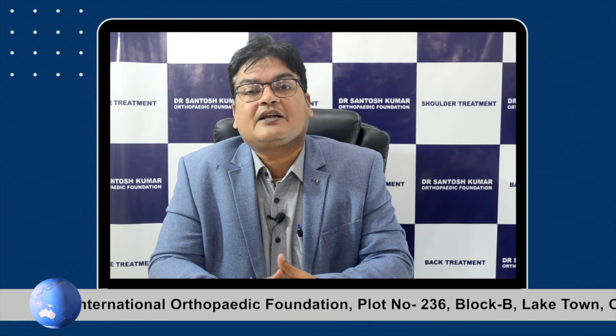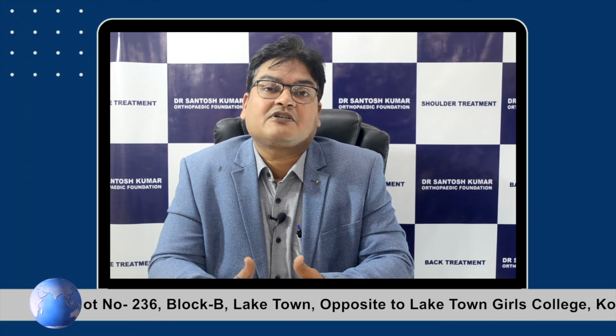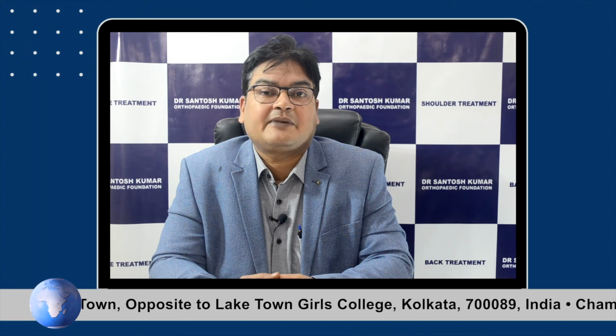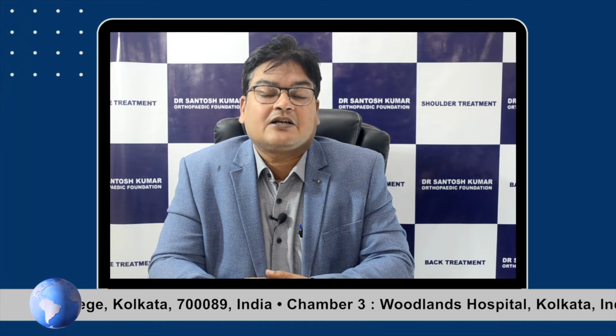So this allows movement to take place and takes care of the pain. The person recovers from pain and movement of the neck is preserved. So this is a very effective surgery in people who are suffering from severe radiculopathy, not being cured with medical management, with other criteria which we can discuss in detail later on.